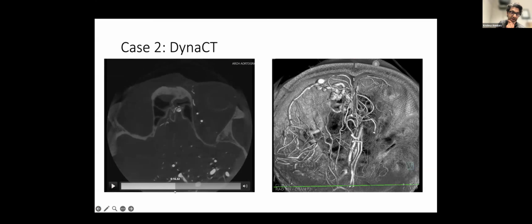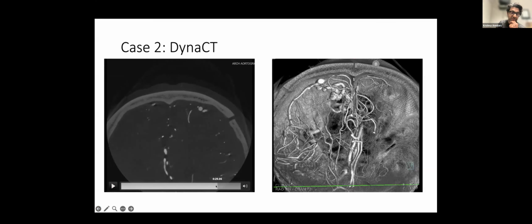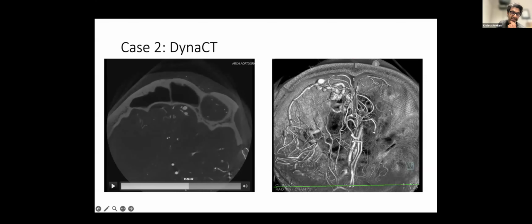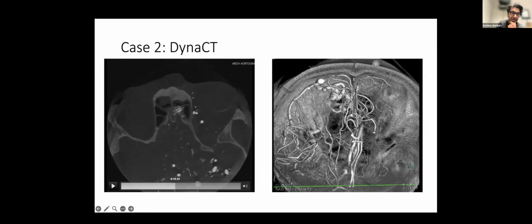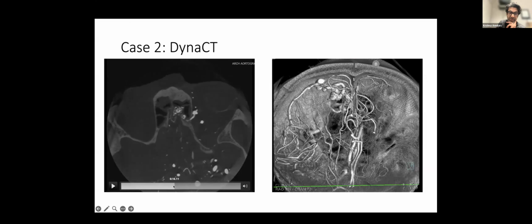If we were able to get past this transition of the pial vein into this sinus and get a microcatheter down, in my opinion, the two microcatheters have to at least get to this level right here, to coil once you get kicked out, to Onyx behind you. But reaching this surgically, in my estimation, is very, very challenging to get down that deep, that far.